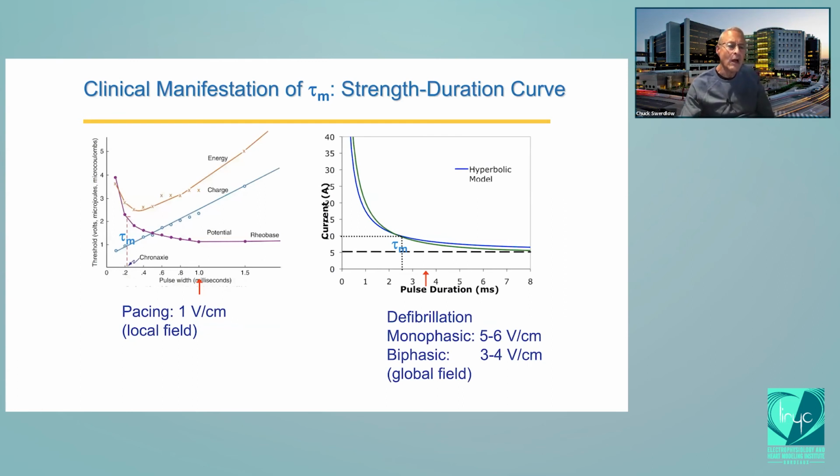I know you saw a strength duration curve when you studied pacing. The question is, what is the optimal pacing duration? And you heard these impenetrable terms, the rheobase, which is the pacing threshold for a very long pulse, and the chronaxie, which is the time at which the voltage threshold is twice what it is at the asymptote, the rheobase.